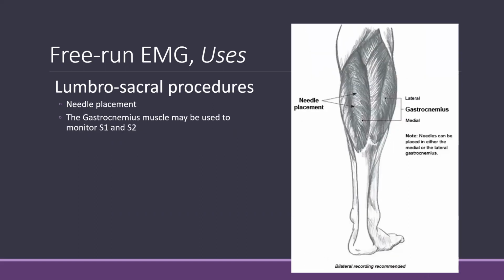The gastrocnemius muscles may be used to monitor S1 and S2. And there's no preference between medial or lateral gastrocnemius.